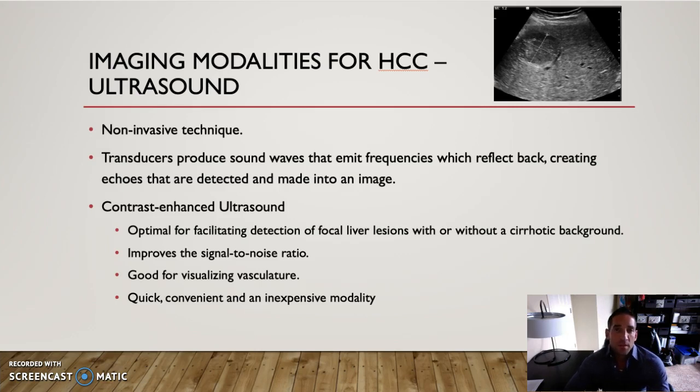Intraoperative ultrasound is the primary method for guidance during surgery of hepatocellular carcinoma tumors, because it allows for continuous localization of the tumor, visualization of the margins, and it allows us to see where the healthy tissue is.